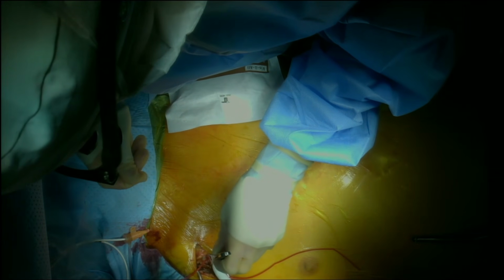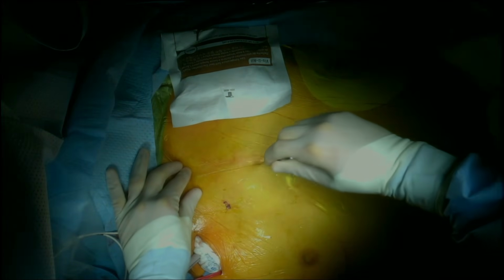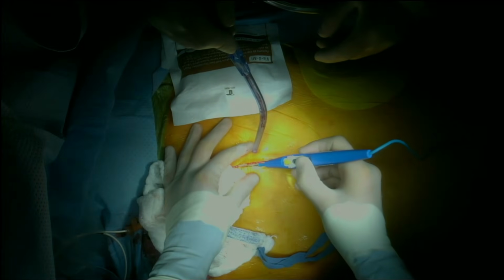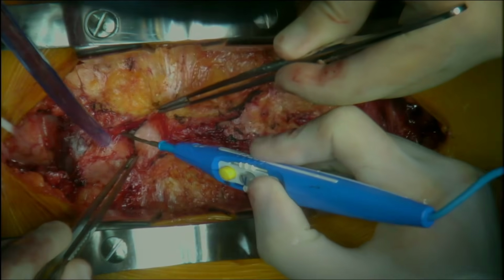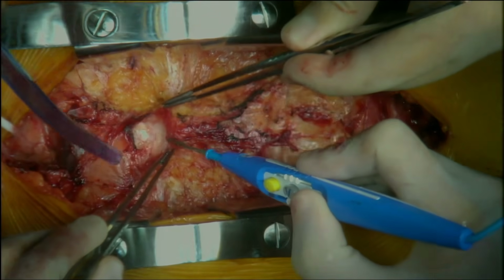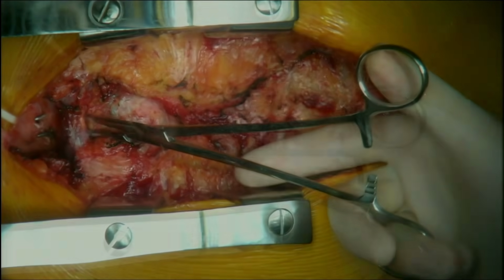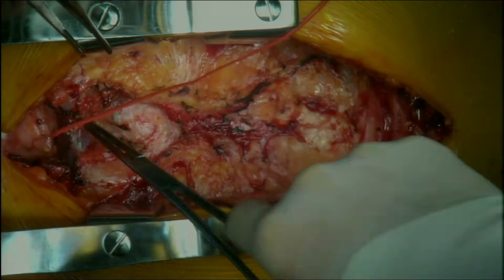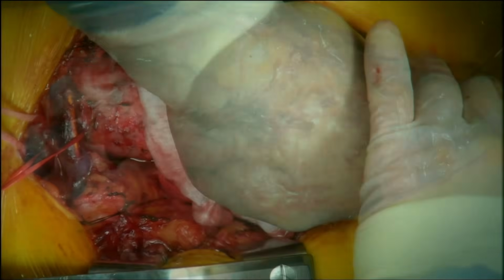Exposure of the right axillary artery is performed for arterial cannulation. A longitudinal midline skin incision is made, followed by redo sternotomy. Extensive lysis of adhesions is carried out. The innominate vein is identified and controlled. The driveline site for the HeartMate is created.